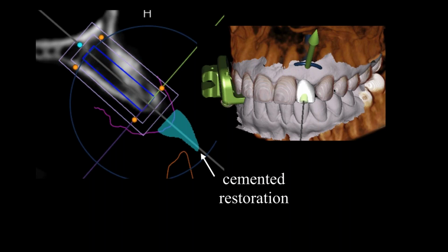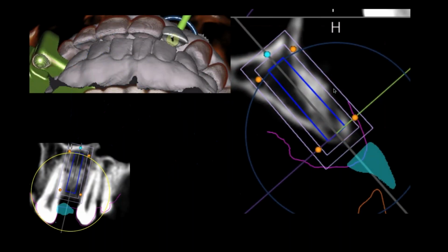Well, my referral was a very good prosthodontist, and he said I would like this screw-retained. So I said, all right, well I'll just take the implant and angle it a little differently so it comes out more on the lingual aspect. Well, now it could be screw-retained. But now what I have to do, you see, is follow that plan. So if I was just going to do this freehand, I might have a tough time putting this in exactly where it needs to go. And then he says he wants me to distalize the height of contour of the implant 1/2 millimeter.